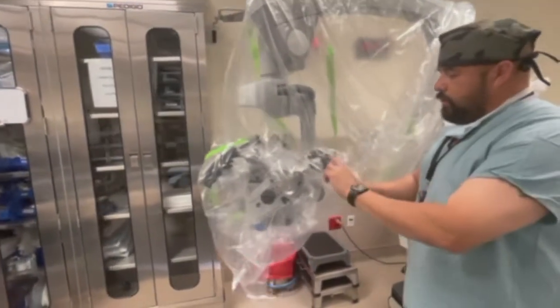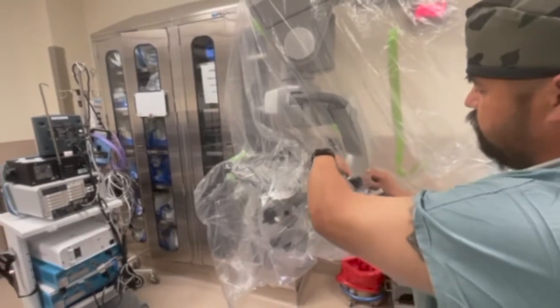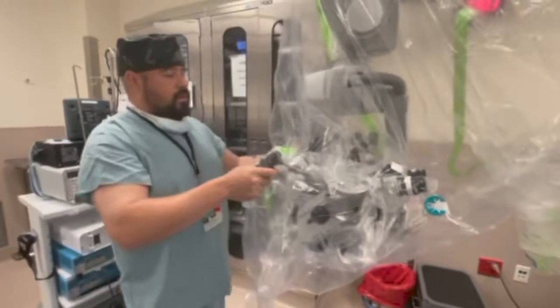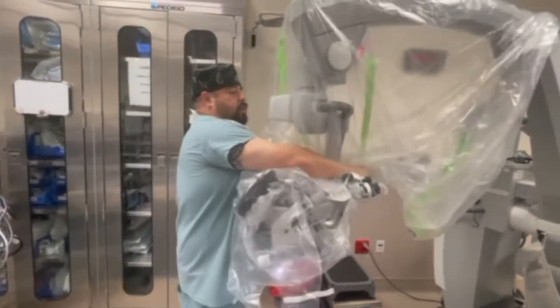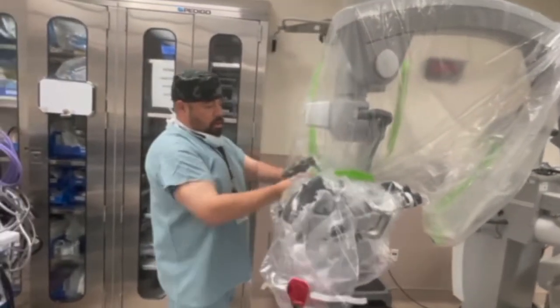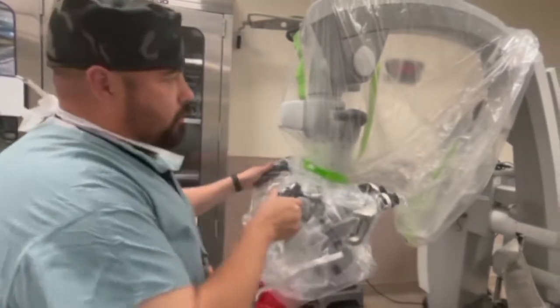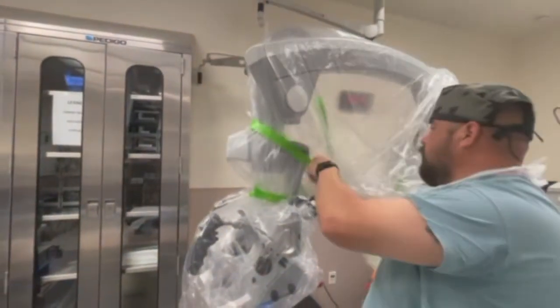Okay, so once you're done wrapping the eyepiece with the Velcro, you look at the top of the scope and it comes with several green stickies that you wrap around the scope, like this one right here. You wrap it around the scope just so the drape is secure. You tie it to the point where the scope is able to move. Once you're done with this first one, you move to the next one. And you're done with the second one.